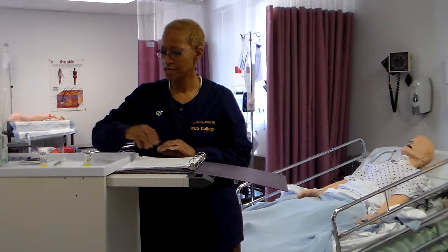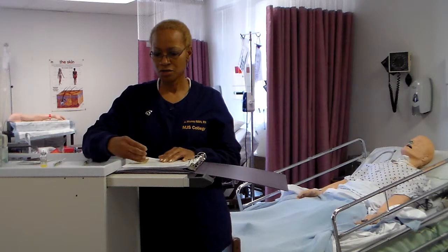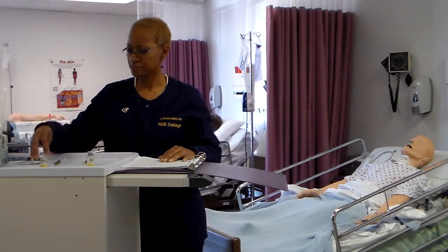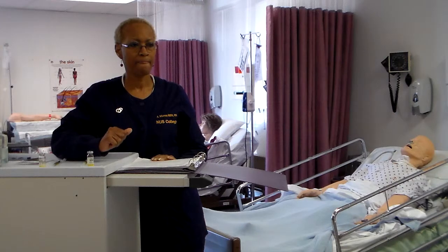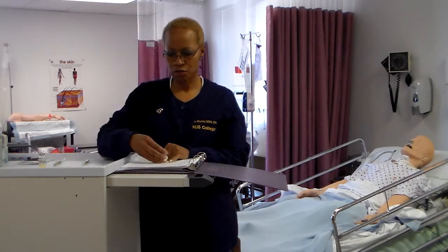First check. Okay. So we've already had our first check for our medication. Check medication before returning to drawer. Second check. Okay, you'll check it one more time.